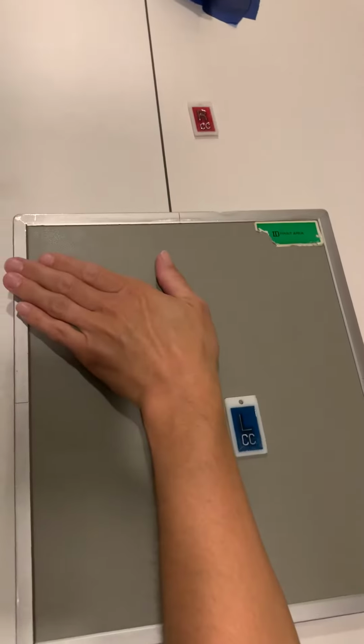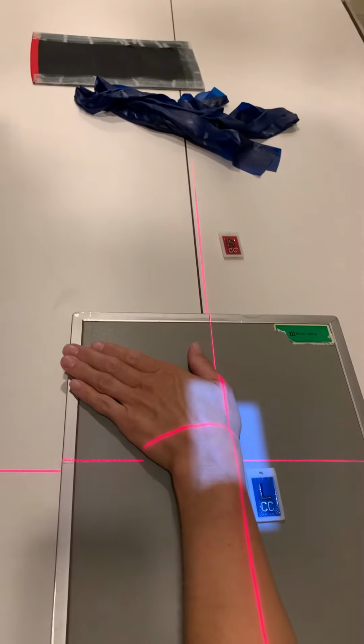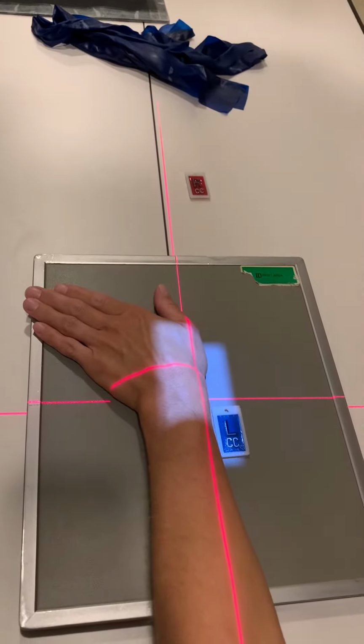In the light field, we are 40 inches SID with an angle on, centered to the image receptor, and we're ready to take the picture.